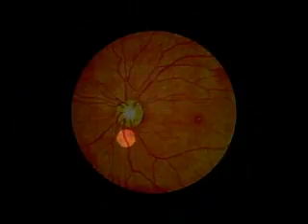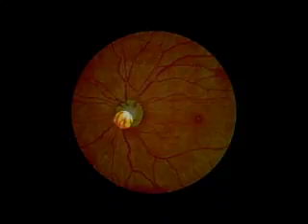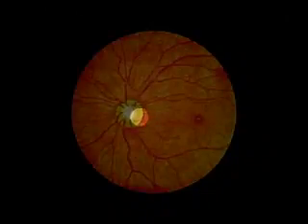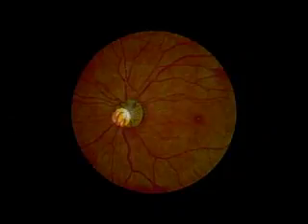Now bring the optic disc into sharp focus by adjusting the ophthalmoscope lens. Note the color of the optic disc, the clarity of its margin, and the size of the physiologic cup. Normally, the disc is yellowish-orange to creamy pink and round or oval with well-demarcated margins. It may be surrounded by white or pigmented rings or crescents. The optic cup to disc ratio is usually less than one to two.